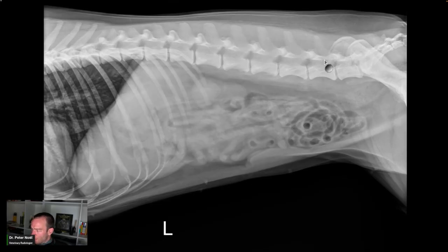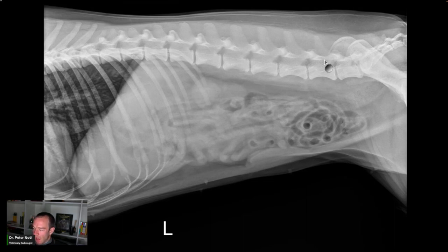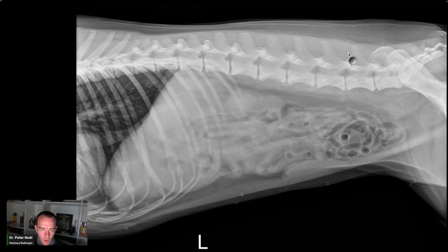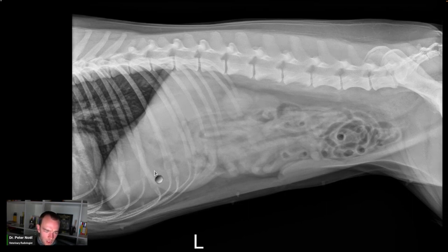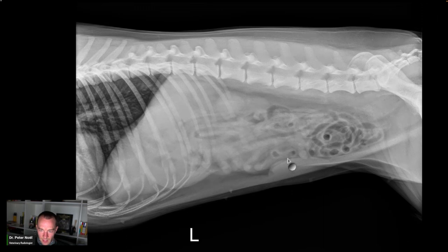This is a 23-month-old dog with two radiographs. Diarrhea started overnight Wednesday, continued intermittently until today. The owner withheld food for a day; when she gave food again, the dog didn't eat it, then had diarrhea again, ate, and is now vomiting. The dog has a history of eating absolutely everything. First thing that caught my eye — is there too much down here? But I actually think there's a rib. The caudal chest is fine, liver fine, spleen fine, both kidneys fine, urinary bladder small and fluid-opaque.